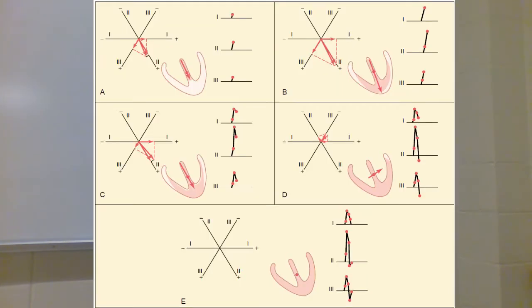Heart rate is determined by the distance between the R peaks, or the distance of the R to R interval. The mean electrical axis tells the interpreter the net direction of the heart's depolarization. The mean electrical axis can be calculated by locating the QRS complex in lead 1 and AVF.